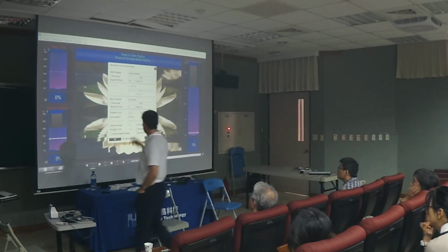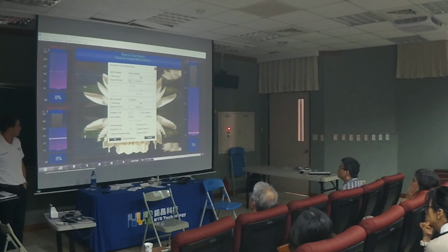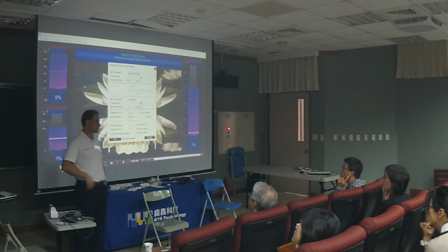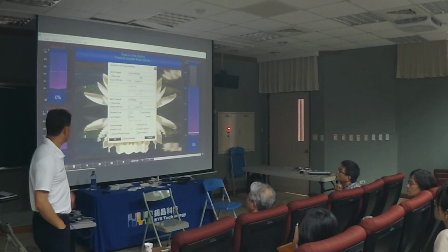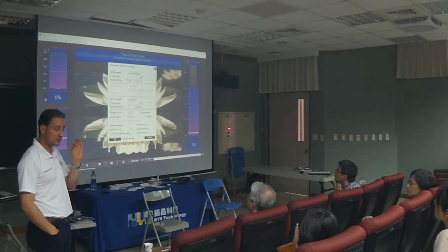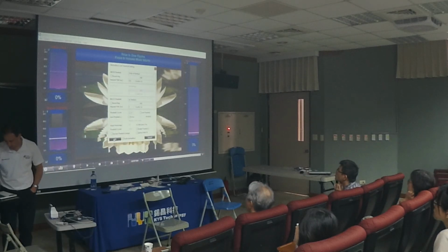All right. So here is the threshold. So here you have the time option. In this case, we're at the inhibit, right? So every time the theta goes above the threshold, this is the inhibit. How do you set up the threshold? Look at the baseline and start from there. Let's say that theta was at 15 during the baseline, okay? Put it at 20 at first, so it's easy for the client. So let's do a replay on this session so I can show you how.